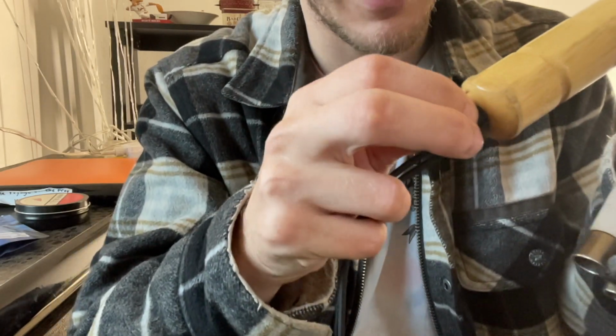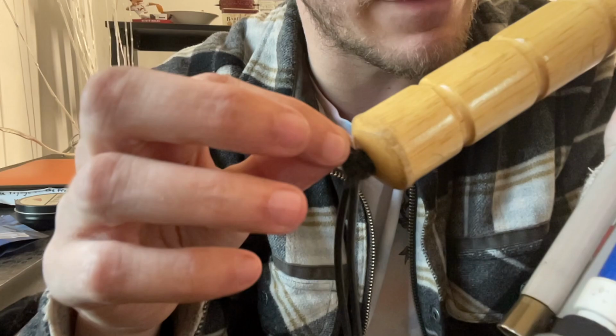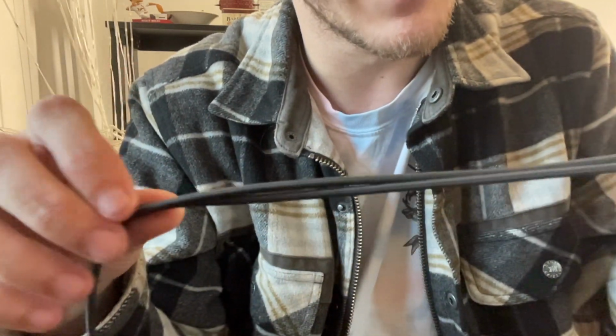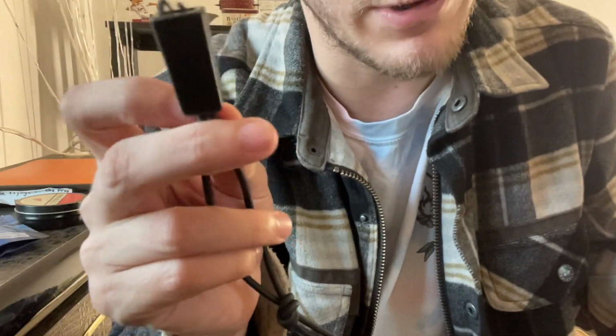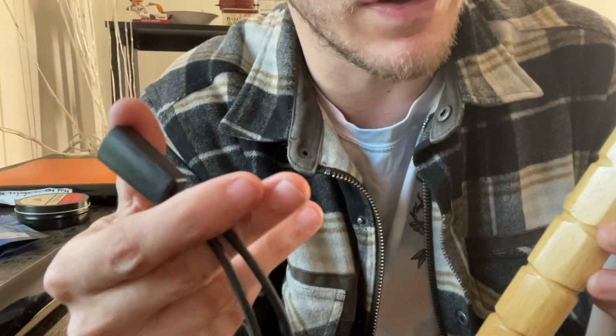This cane is starting to fall apart, and so really up close at the loop, we actually have a frayed bungee, and I'll show you how that's affected the rest of the cane. But this bungee is used for kind of two things. There is a knot about 3 inches from the top that forms a loop, and Utch canes specifically have this plastic loop piece at the top to kind of keep everything together.